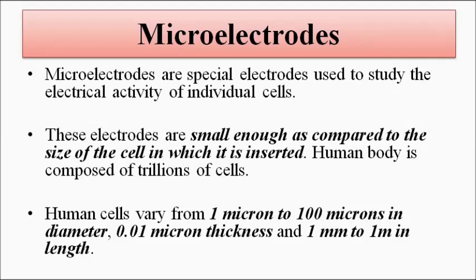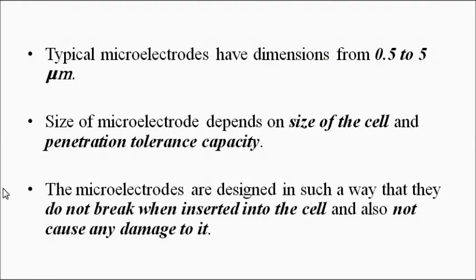So microelectrodes are very small as compared to the size of the cell into which it is to be inserted for the measurement of biopotential. The microelectrodes are specifically of the dimension ranging from 0.5 to 5 micrometer. And the size is governed by, as I said, two important factors.